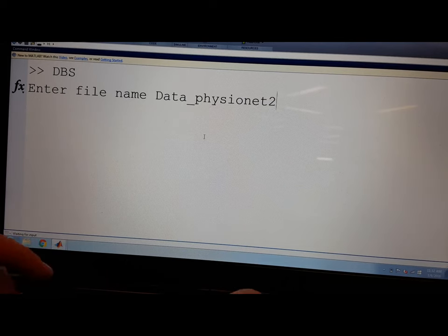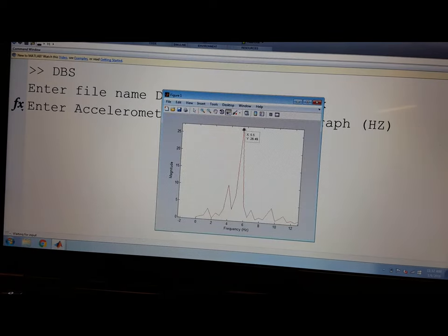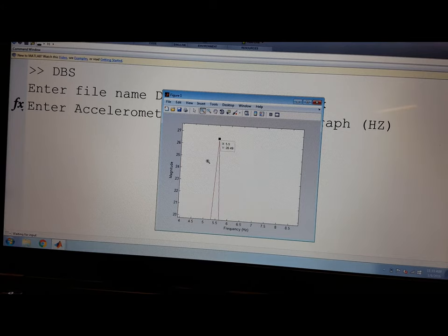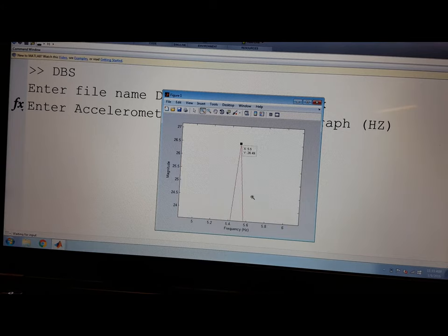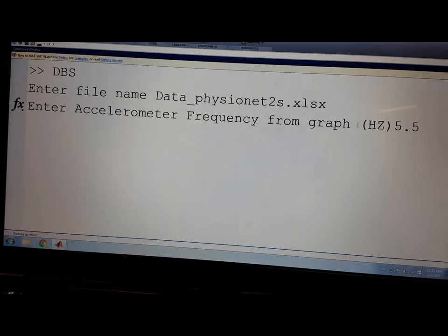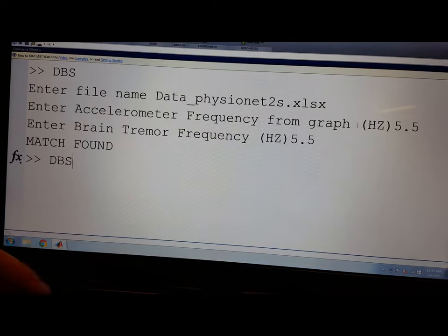Open the Eureka software and initiate the accelerometer recording. The software will begin recording tremor data. The Eureka software then produces a frequency plot where the surgeon can choose the correct frequency of the tremor.